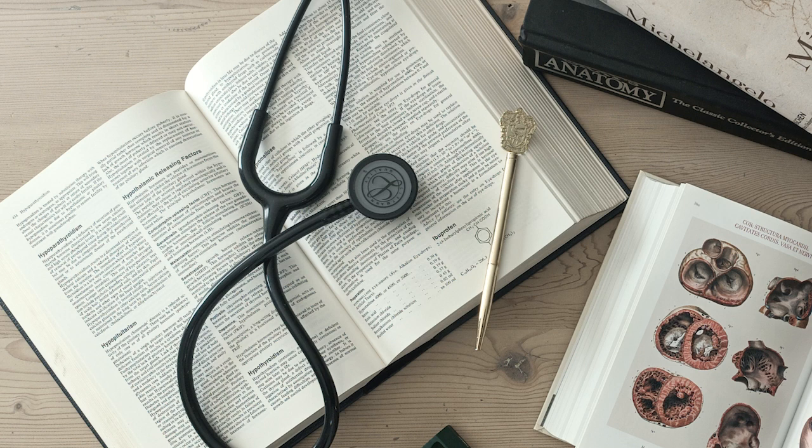And the third type is the best case scenario for an APC where it doesn't cause too much disturbance, right? Yes, relatively speaking. The third is an APC with normal ventricular conduction. In this case, the early atrial impulse arrives at the AV node after both the absolute and relative refractory periods, meaning after the T wave of the previous beat is fully completed. Arrives when the coast is clear.